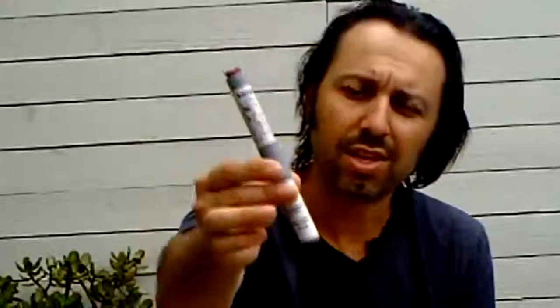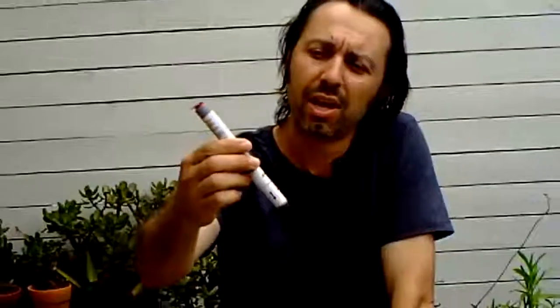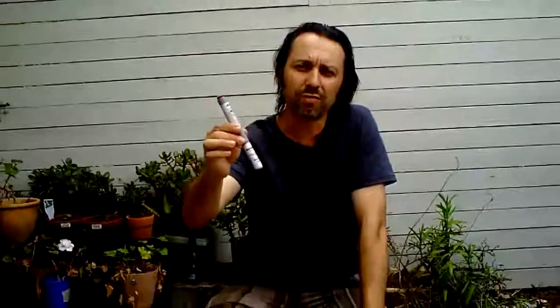Here is the Anapen. As you can see, it's a pen-type shape and it has instructions on how to use it printed on it. This is a trainer pen, and I recommend that you always get yourself a trainer pen so that you can show friends, family, as well as the children or adults who will be using it exactly how to go about using it.